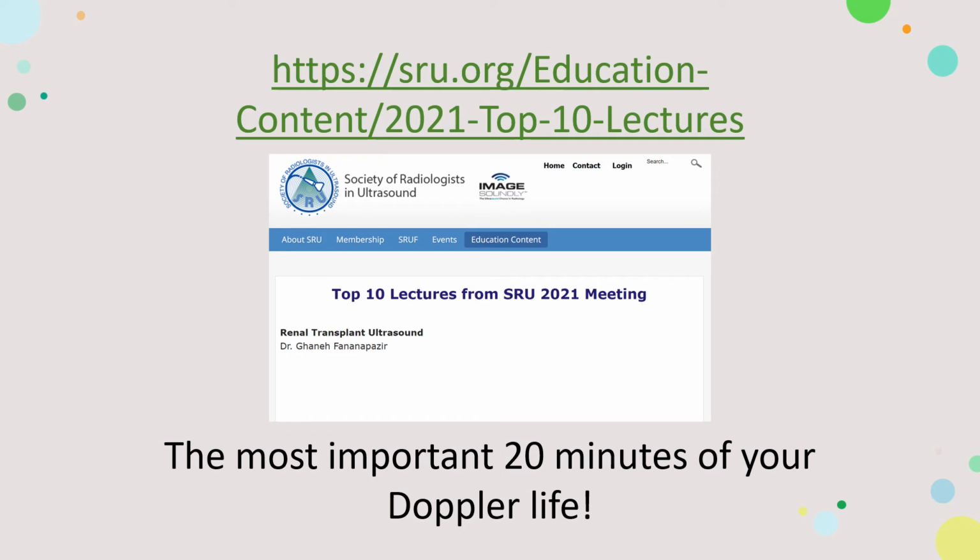If you Google SRU top 10 lectures or go to this link, he has a fantastic lecture, and all of this is based on his lecture. It's only 20 minutes, but it will tell you pretty much everything you need to know about interpreting a renal transplant, and it's not just Doppler. He covers other topics, hydronephrosis and ATN and rejection and all that kind of stuff. I don't know how in the world he does it in 20 minutes, but it is fantastic.